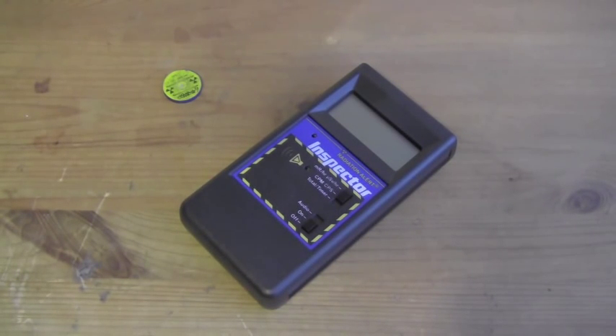This is a demonstration for the Inspector Survey Meter with internal Pancake GM Probe. It performs general purpose survey for alpha, beta, gamma, and x-ray radiation.